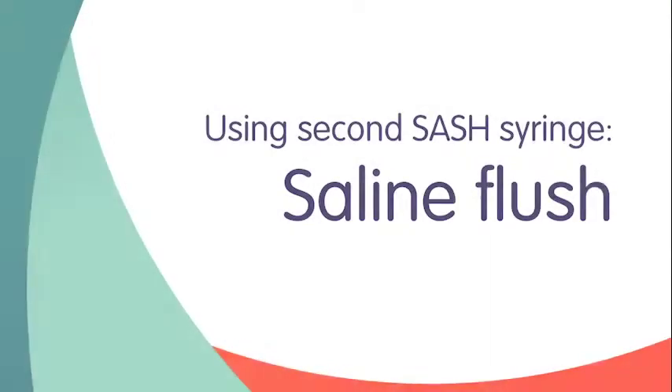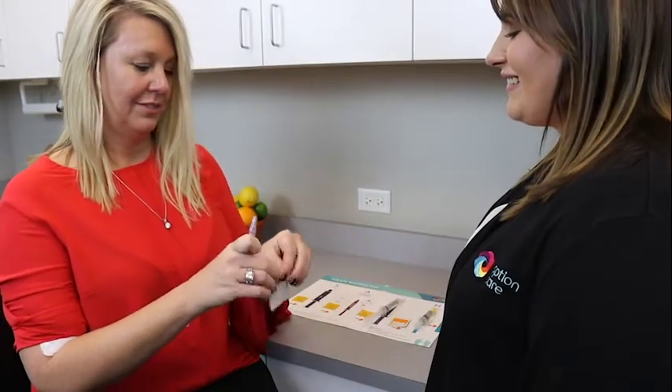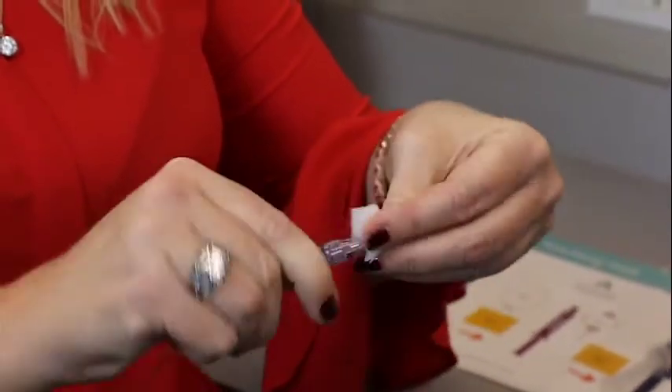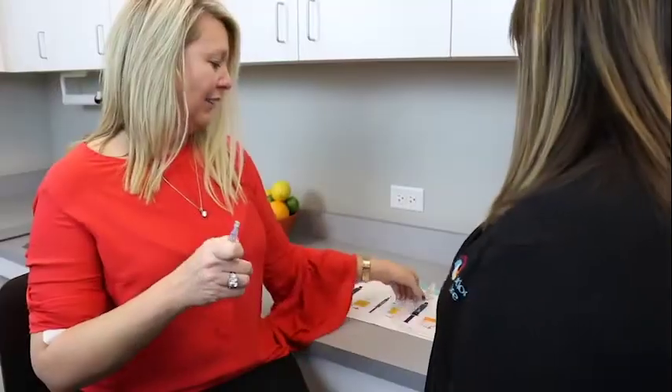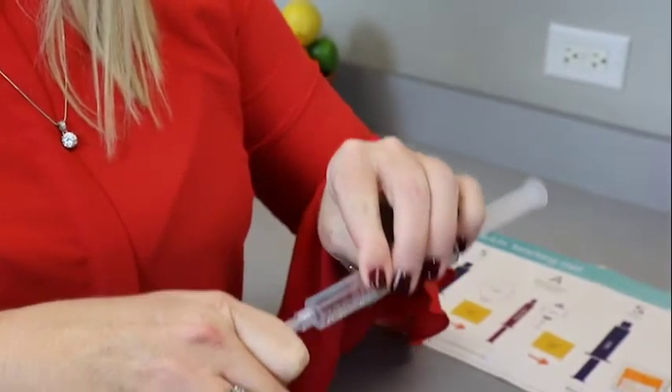You are now ready to flush your IV line with saline again. Scrub the needleless connector on your IV catheter with an alcohol wipe for at least 15 seconds and allow to air dry. Remove the protective cap from the saline flush syringe. Attach the saline flush syringe to the needleless connector on your IV catheter.